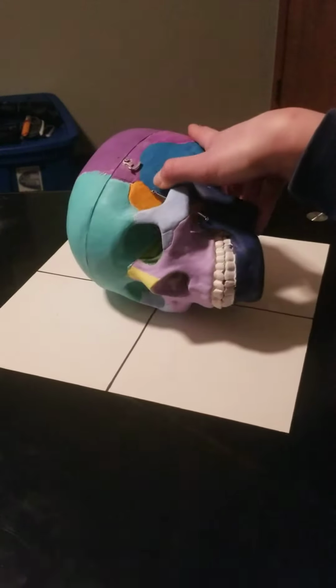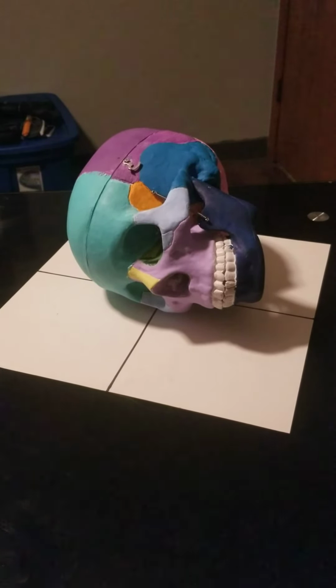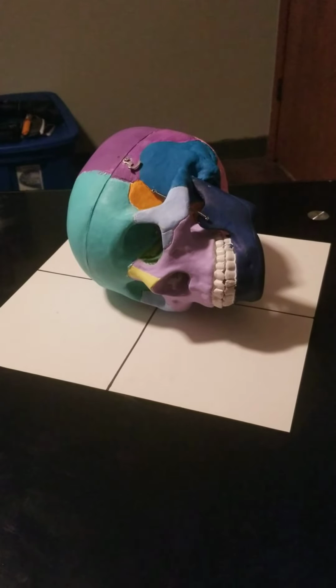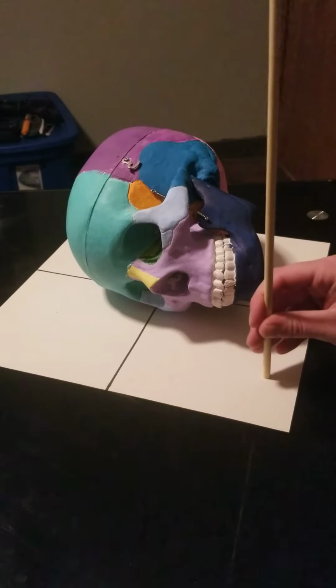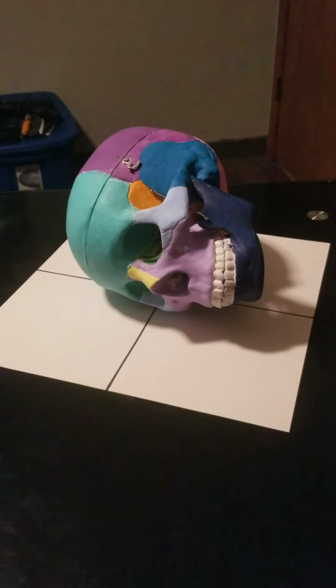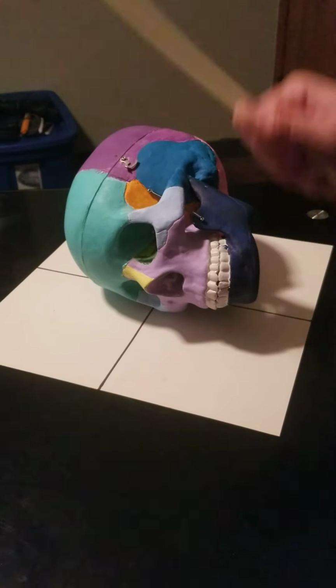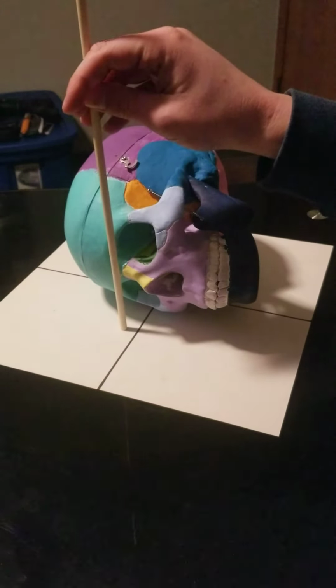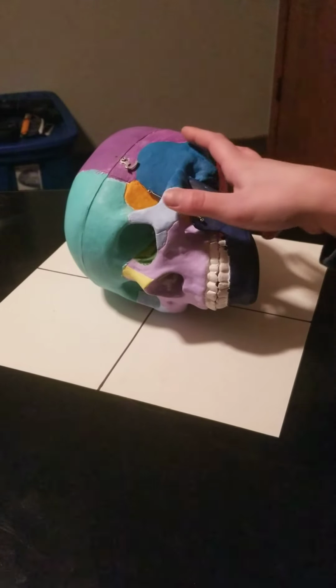For my next projection, I'm going to do the lateral nasal bones. For this projection, it's going to be about the same as my regular facial bones, but I'd have a 10 by 12 crosswise IR, and I'd be doing 2 exposures, one of each side for comparison. I'd want my patient again in the anterior oblique position with their MSP parallel, their head lateral, and their IPL perpendicular. I'd want to center my IR to a ½ inch distal from the nasion.